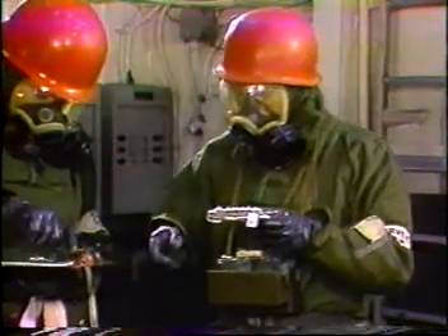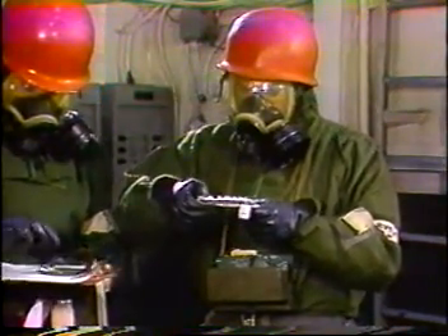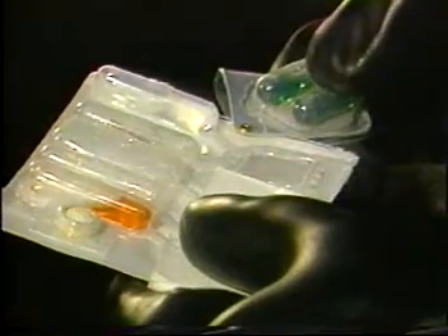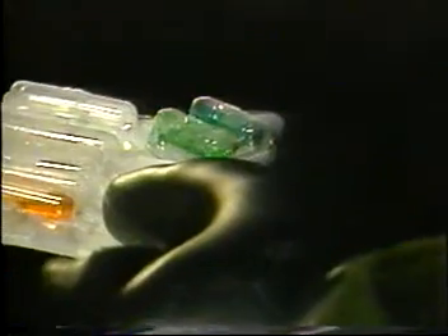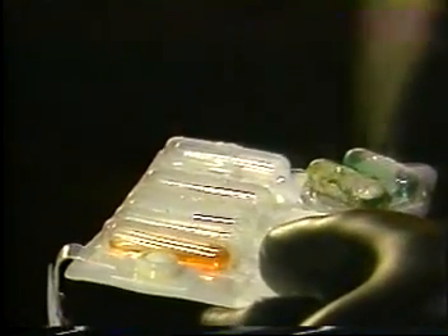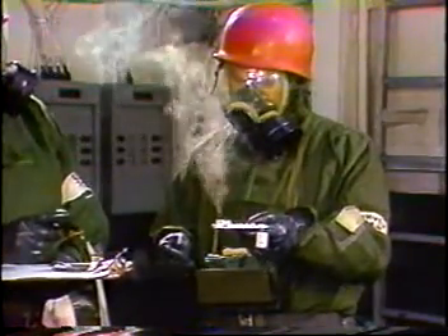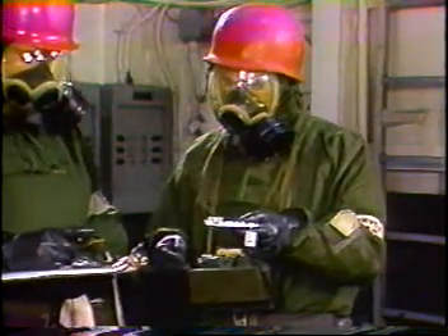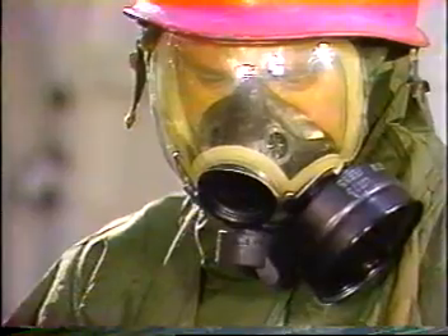Hold the sampler detector horizontal. Swing the heater assembly away from the test spot. Finger crush one of the green number four ampules in the heater, and then swing the heater over the test spot. Warning: the heater becomes extremely hot and emits toxic fumes. Hold the sampler detector away from the body and leave the heater over the test spot for a period of two minutes.